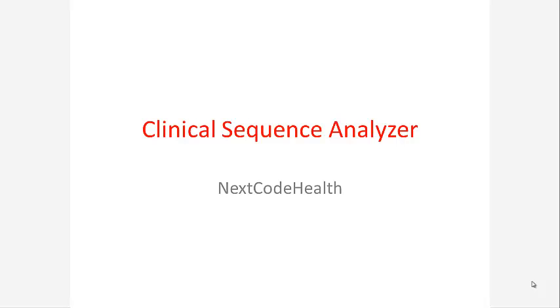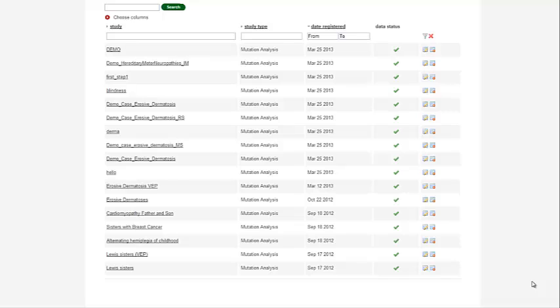The following is a demonstration of the Nextcode Health Clinical Sequence Analyzer. We will demonstrate the properties of the Clinical Sequence Analyzer using an actual case study that we solved using the tools you will see in the demo.